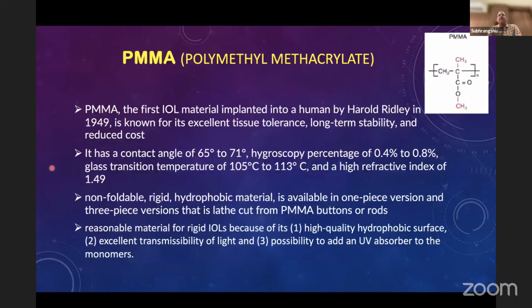Now coming to the various materials, PMMA, or polymethyl methacrylate. PMMA, the first IOL material implanted in a human by Sir Harold Ridley in 1949, is known for its excellent tissue tolerance, long-term stability, and reduced cost.